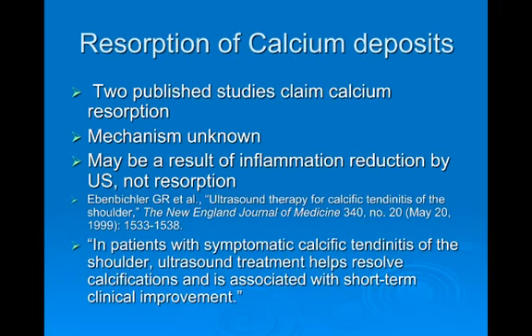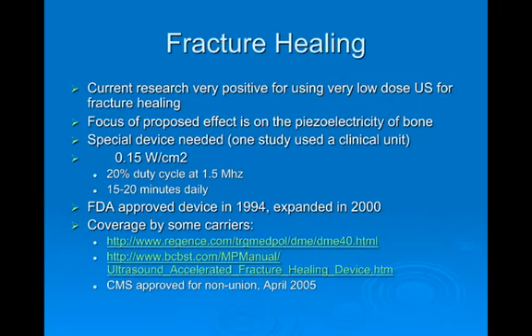And we're probably seeing a reduction by decreasing more of the inflammation, increasing range of motion with stretching, rather than actual resorption of the calcium deposit. Now, there's no real known mechanism for why this would change the calcium deposit there. So just keep that in mind. Very small amount of studies there. Probably not something to be doing in the clinic.